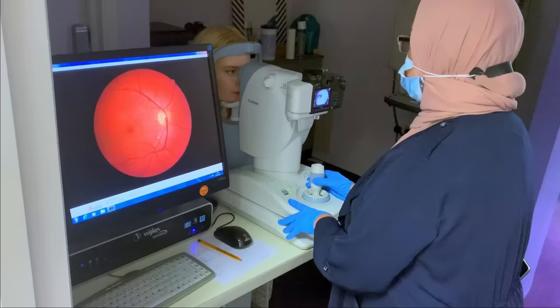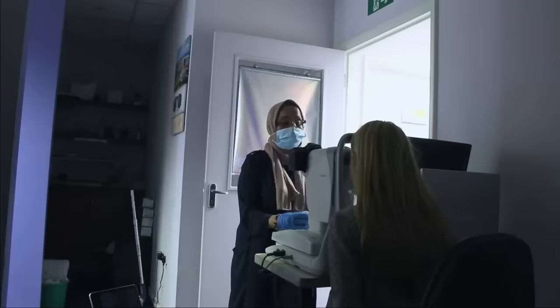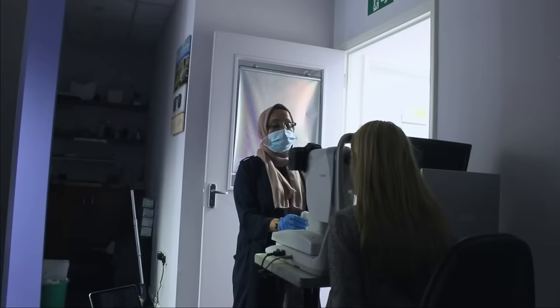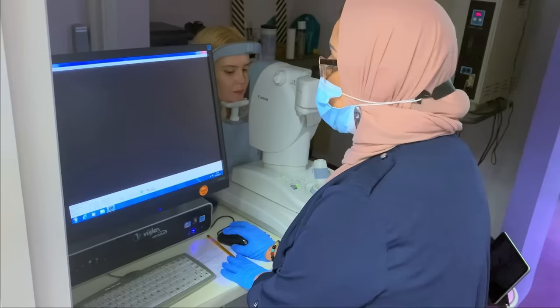Are you ready for the other eye? Same thing again. Look at the dot here. Keep very still. Again, there's going to be a flash of light. Excellent. Beautiful image. Okay, let me just save those images, and then I'll show you. Come on over and I'll show you.